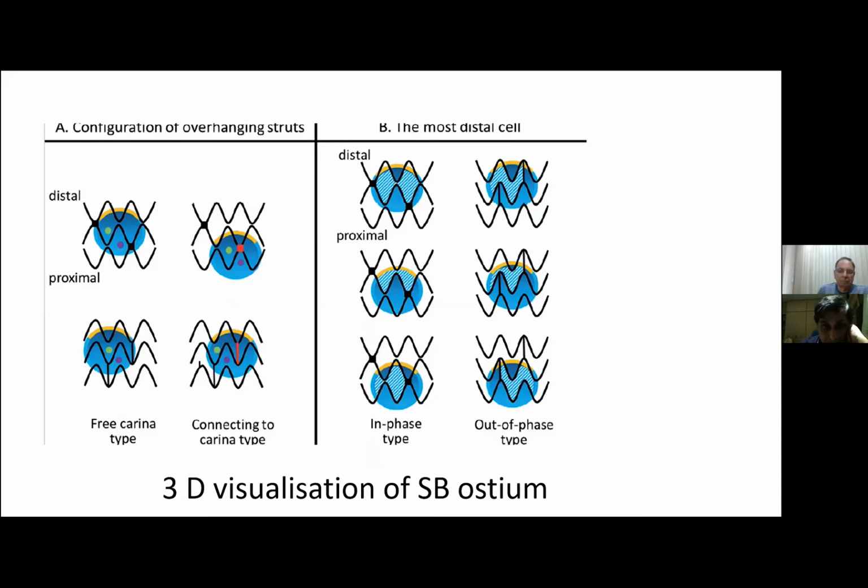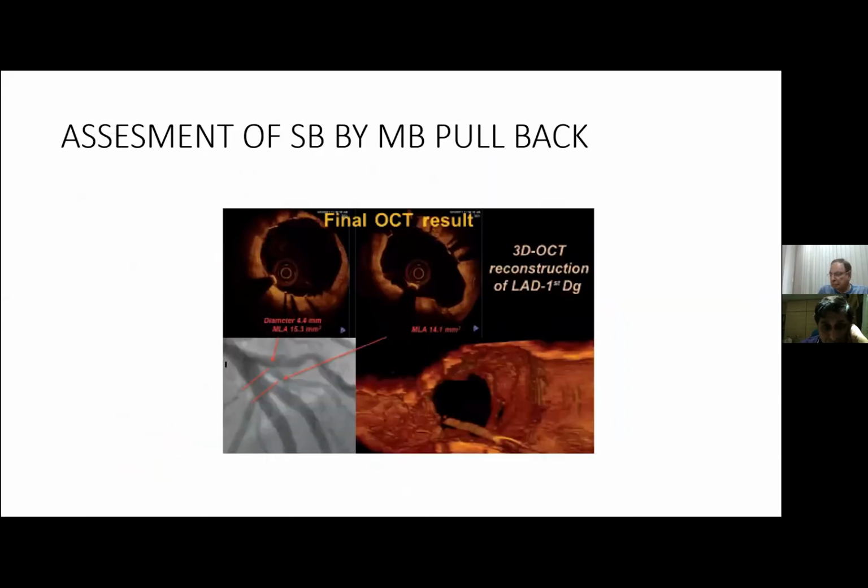There are connectors. And if your wire does not cross through a proper position, you may end up having a lot of difficulty in getting more hardware through that wire, and you are stuck sometimes. I don't want to say that every wire cross of a side branch will need an OCT, but if you're not able to cross, just put in an OCT and you will know you were going through the wrong branch.